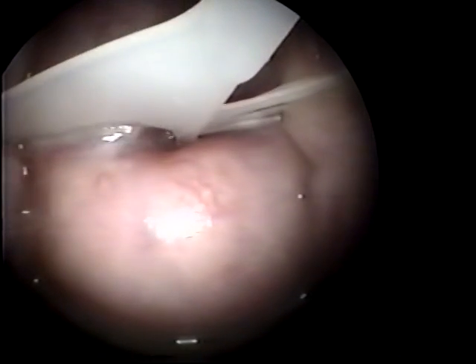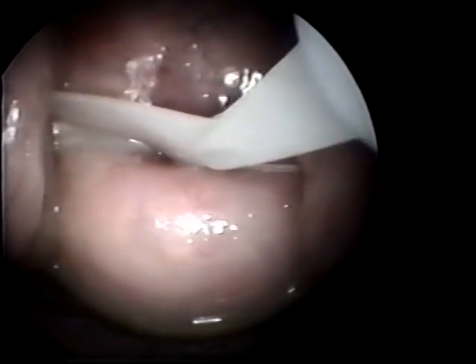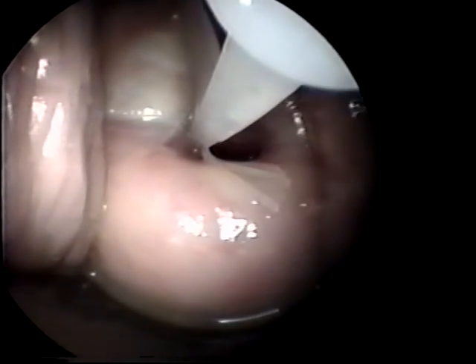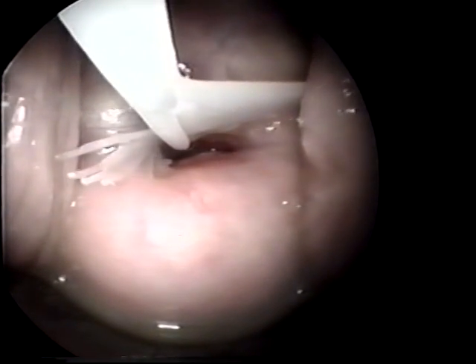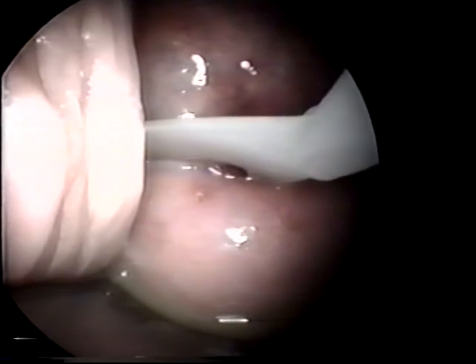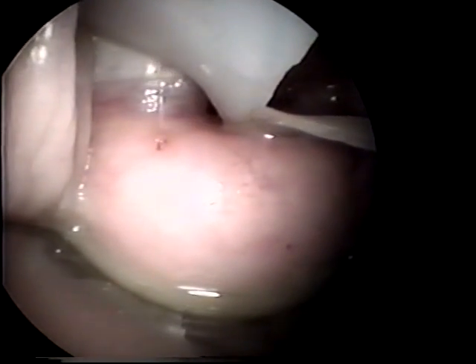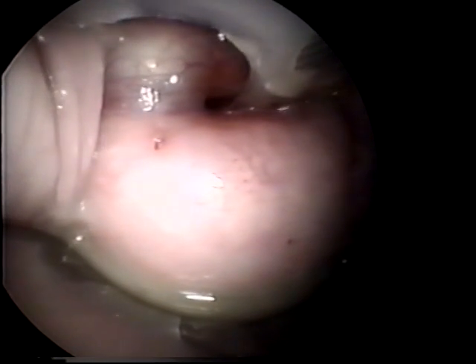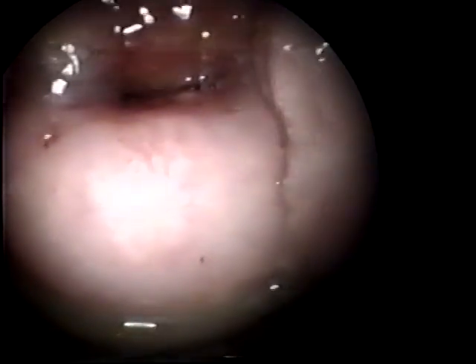The insertion of CellSweep must be gentle and complete. While the solid blade samples the ecto-cervix in a 360 degree clockwise motion, the bristles accommodate variations in cervical anatomy. Gentle and steady pressure applied to the ecto-cervix assures proper sampling. To ensure a complete 360 degree rotation, it is recommended to finish the rotation 15 degrees beyond a 360 degree turn. After sampling is completed, no bleeding is noted.